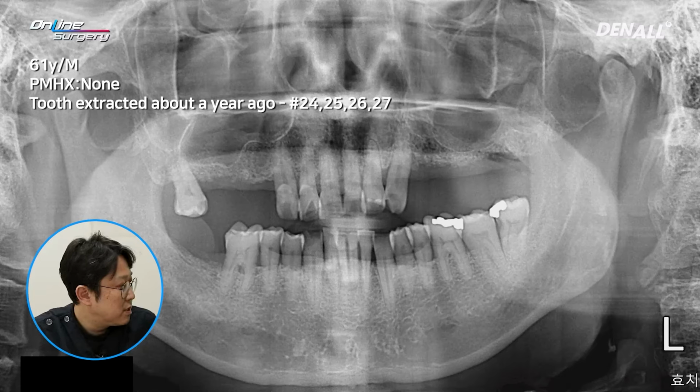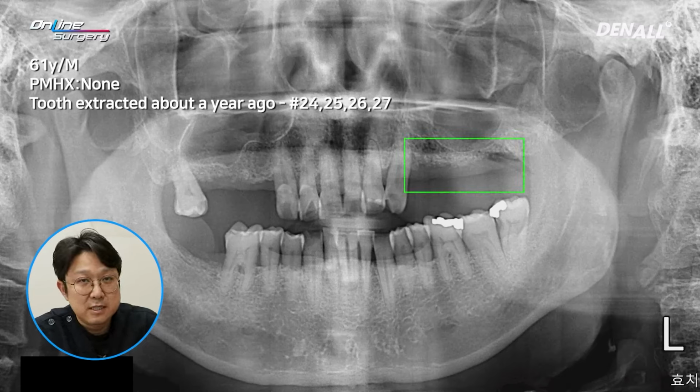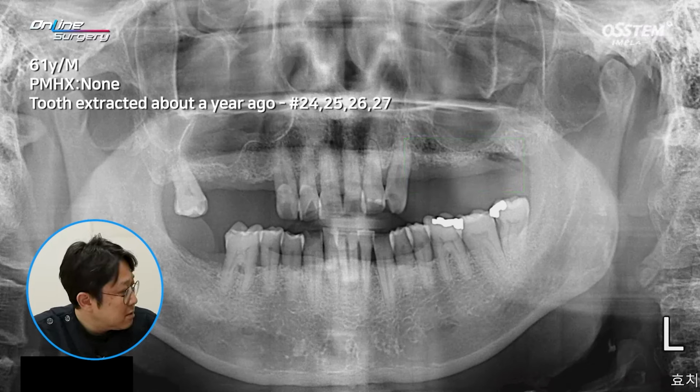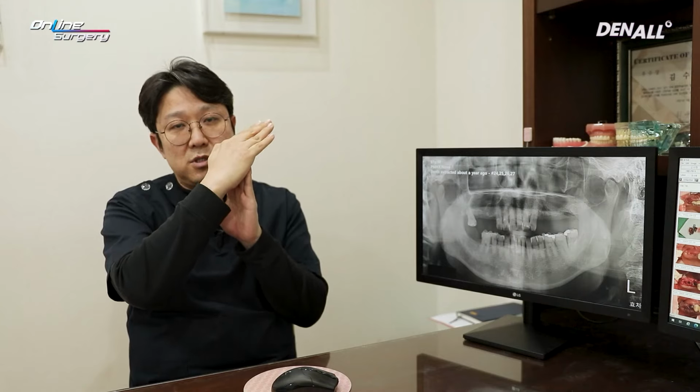Number 14 and 16 surgery was done ahead, and today I want to talk about placing implants in number 24, 25, 26, and 27. The residual bone for number 24 and 27 looks okay. Number 25 and 26, especially number 26, residual bone seems to be lacking. There was a septum and there was also inclination. Number 26 looked somewhat more favorable compared to number 25, which had distal inclination. In number 26, there was mesial inclination, so this was of concern as well.